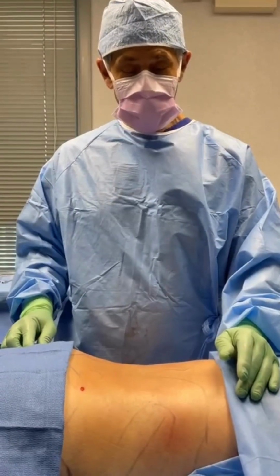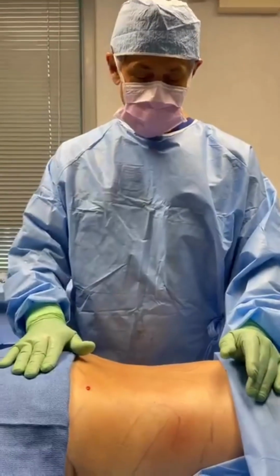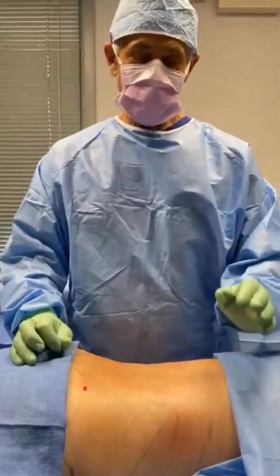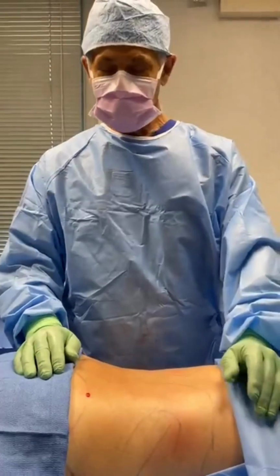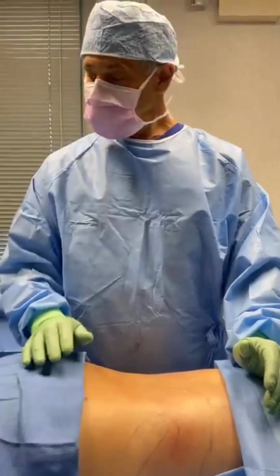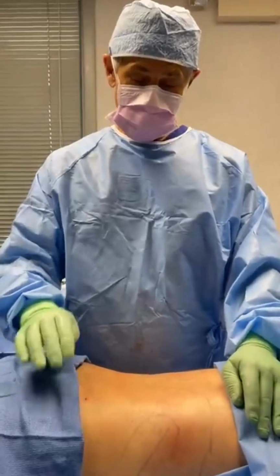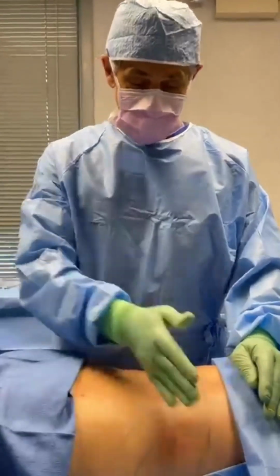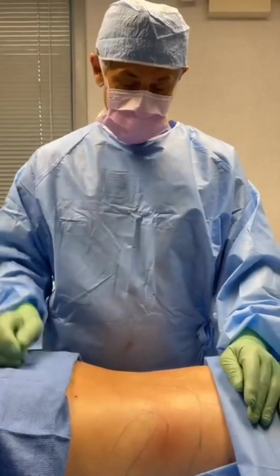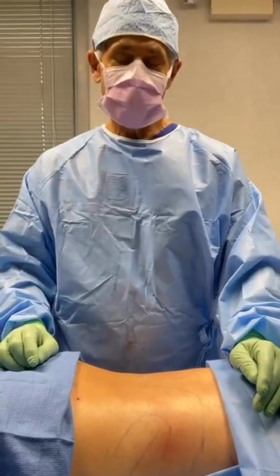So in a moment we're going to have our patient turn over. You awake? I am awake. She's awake. So we'll have her turn over and then we'll do the Renuvion plasma skin tightening on the abdomen on the front side. That skin tightening with the Renuvion can be done anywhere on the body, really. But we needed to get these waists sculpted in and get our little dimples created there. So it's looking very nice.